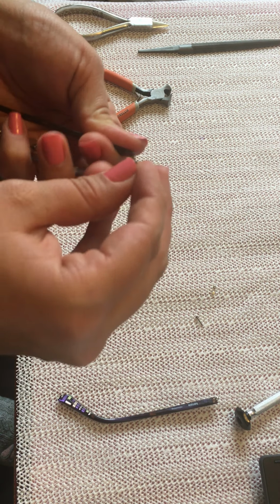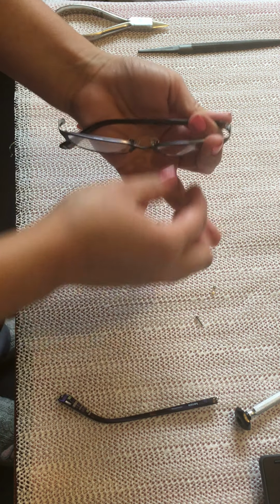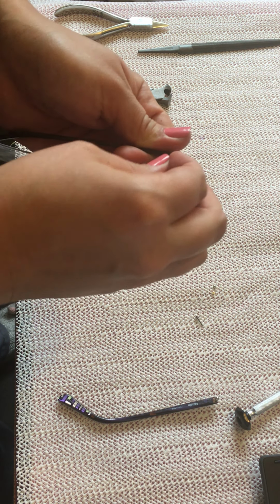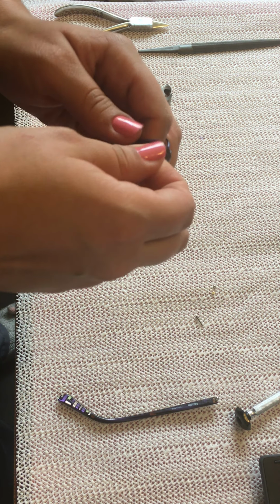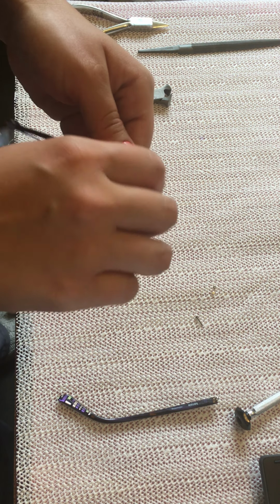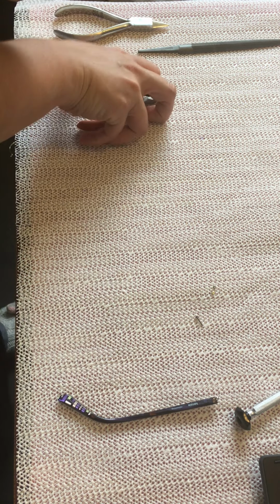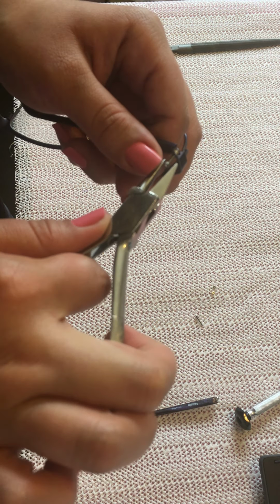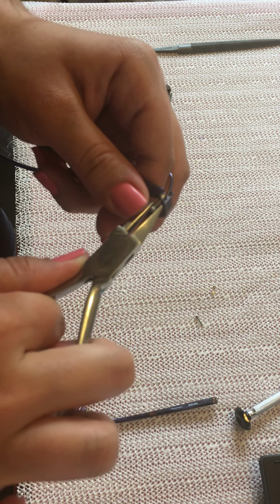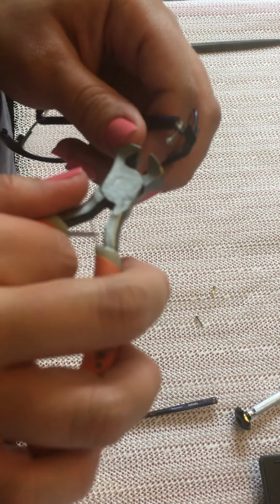Okay, I'm gonna put the bolt. I'm gonna screw it with my finger as much as I can, and then I'll either use the needle nose plier, or I might use my clipper, being really careful. Okay, so I can't do it with my finger anymore. I'm gonna try to do it with the needle plier. Okay, so for me at least, it starts to slip. So I'm gonna try to do it with my clipper, being really careful.